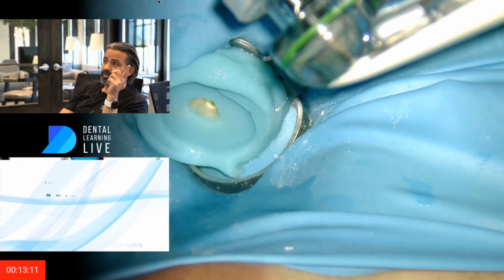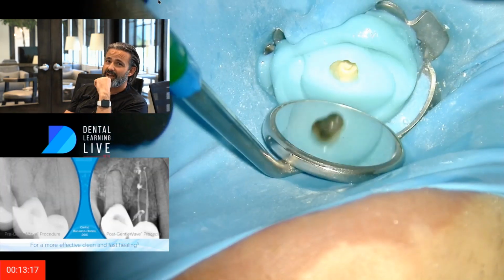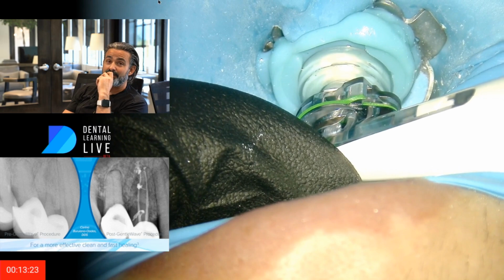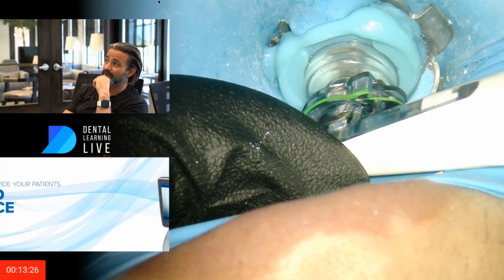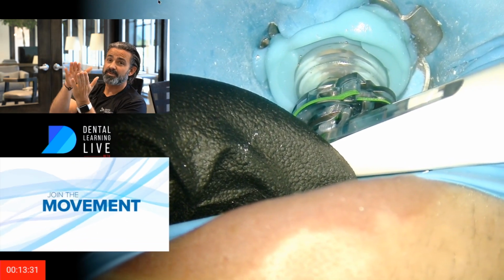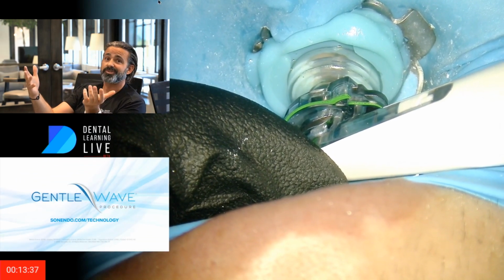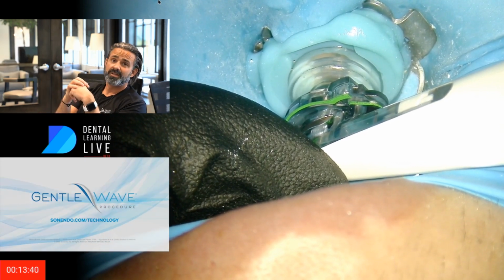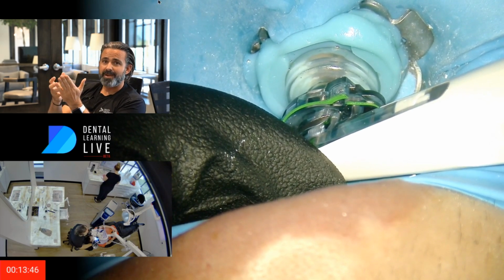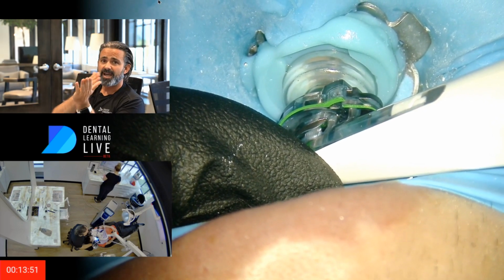Now, it's a really fascinating story, but pay attention to this video as well, because you can see how much this guy is wiggling on me and how much I'm having to stop and start again. But the trade-off is that could be a file going on here, and I want to show you how this thing works. So anytime you disconnect from that interface, by the way, the console stops. And then you can adjust, make sure you talk to the patient, tell them what you're doing, why he or she needs to hold still, and check your platform, and then re-engage. And then the time clock will go through this repriming phase before the clock starts counting down, and then it just picks up where you left off.